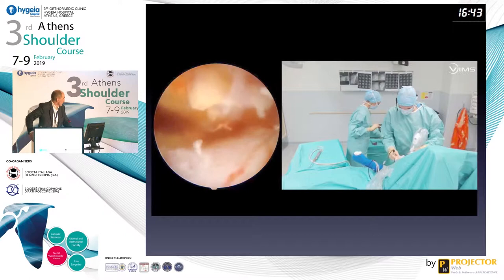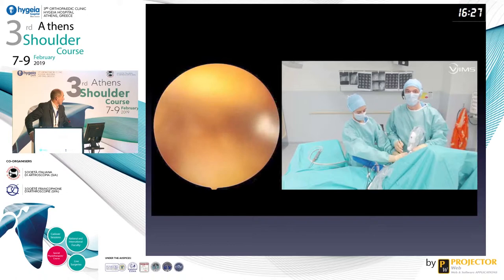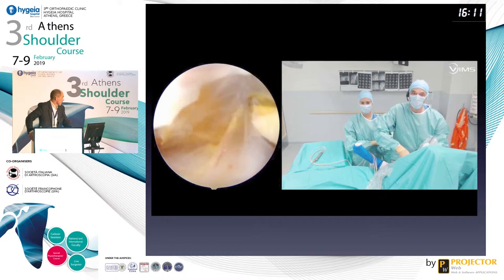So as soon as you have decided that you are at the distal part, this is the proximal part. You can see the lat dorsi is white. And just behind the lat dorsi, you have something red, which is the muscle belly of the teres major. And as it is a conjoint tendon, it's very difficult to separate them. And you have to make this dissection, and it's not so easy. Another point is that the lat dorsi is very thin, so with your electrocautery, it's very easy to damage it, and you have to take care about that.